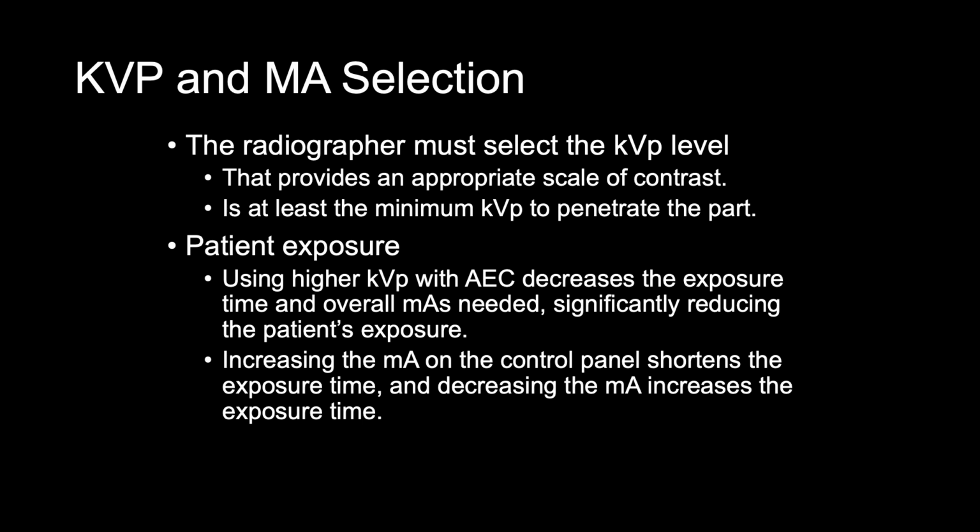AEC controls only the quantity of radiation reaching the image receptor and therefore has no effect on other image characteristics such as contrast. The kVp for a particular examination should be selected without regard to whether an AEC device is used or not.